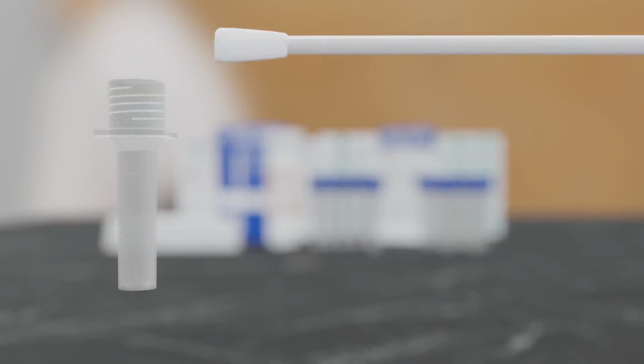Sample should be processed in the extraction buffer as soon as possible after collection. Sample must be mixed in the extraction buffer within 30 minutes of sample collection.